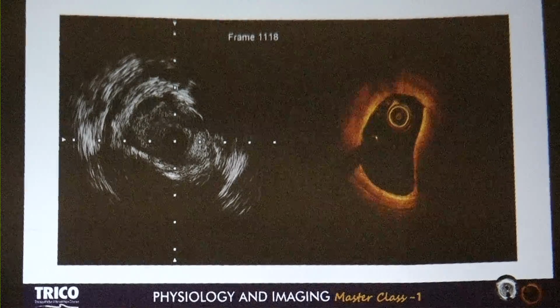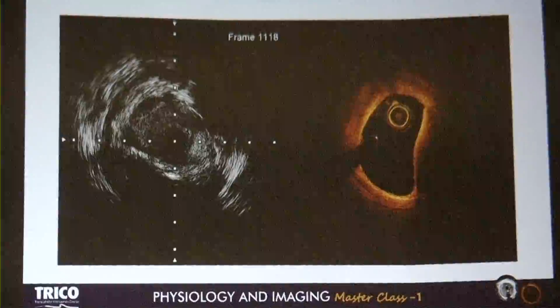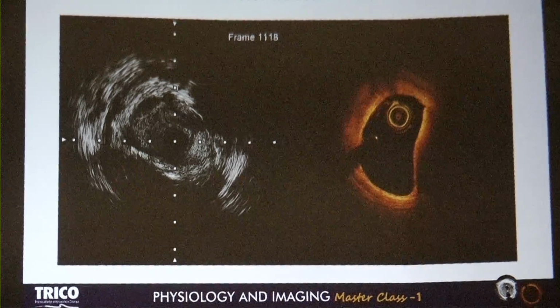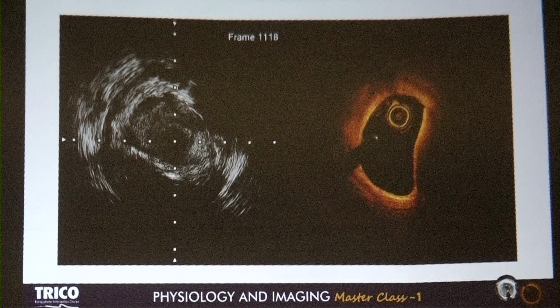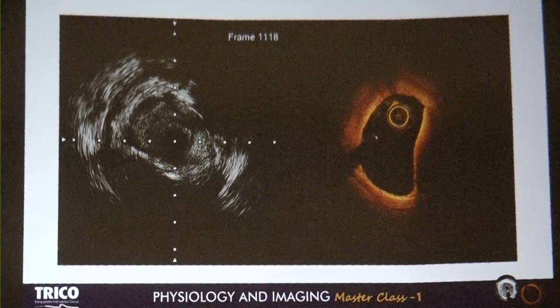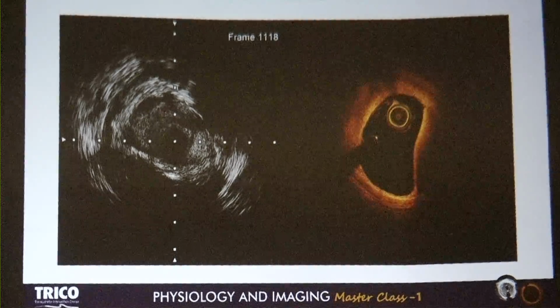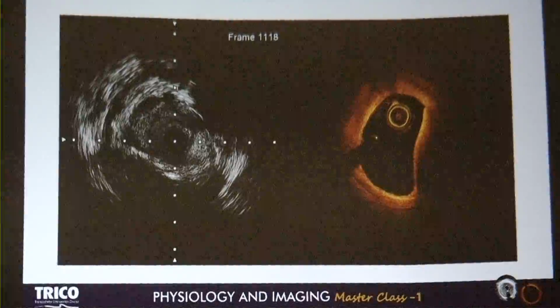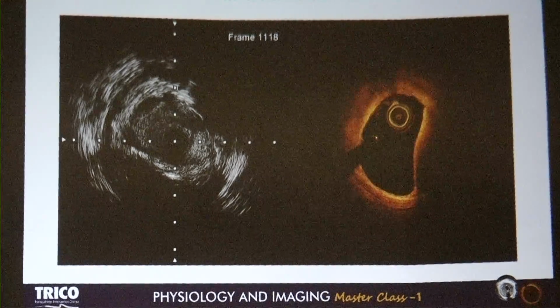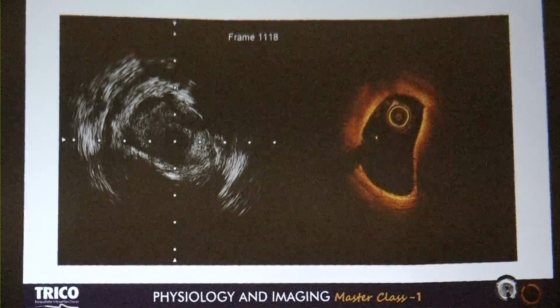But the plaque burden just beneath this thin cap is very suggestive that possibly we are dealing with a thin cap fibroatheroma over here. But an OCT run at this particular place, proximally and distally, could give some idea about what's going on. A dissection flap can give some clue about a subintimal hematoma present here.